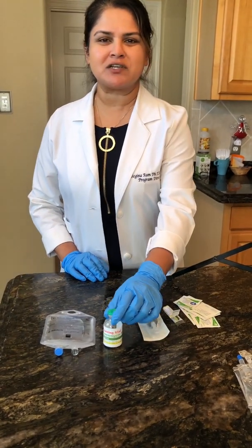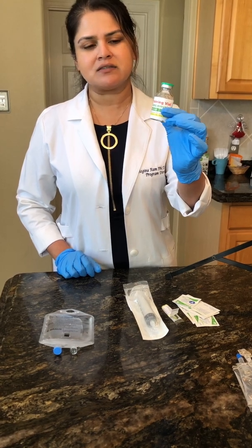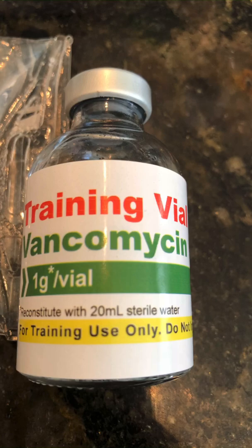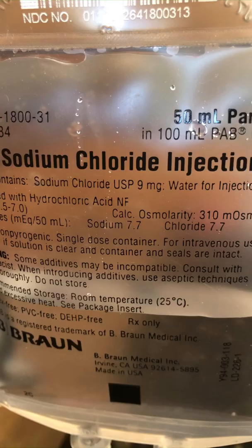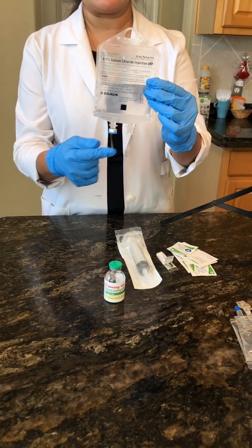Hey guys, today we're going to do the demonstration for a powdered vial — this is vancomycin. You should have this in your lab kit. Today you're going to remove your vancomycin, your IV bag, and the 50 ml sodium chloride. It will be attached to some tubing — that's okay.